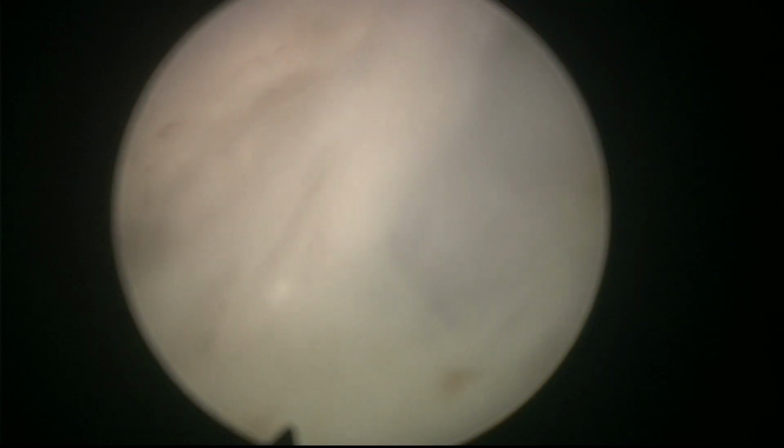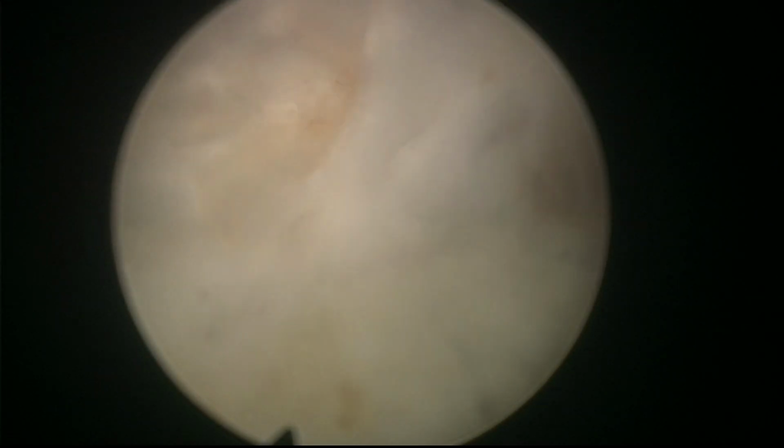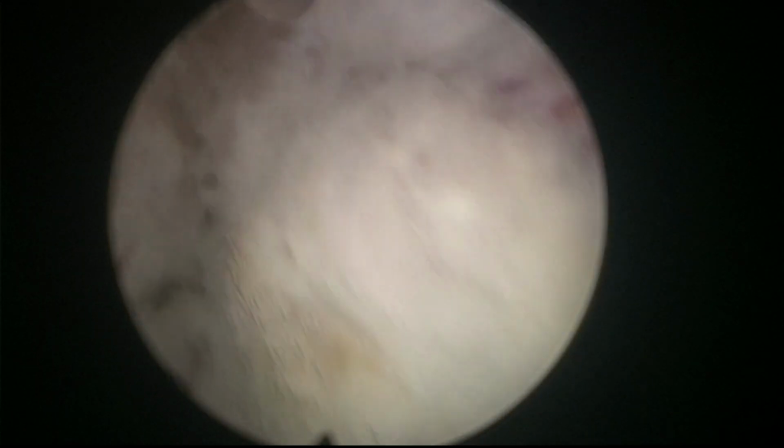The length of the posterior urethra is much more than the anterior urethra. Of course, if you get under the adenoma, it's a straight line to the bladder. You don't have to go up and over the middle lobe. This is the sphincter edge. I'm being very careful to try to preserve the sphincter the best I can.